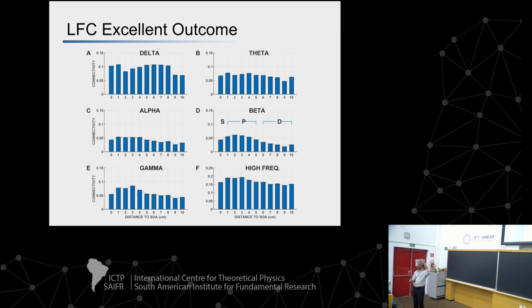If I look at all the different frequency bands that I mentioned earlier, I see that profile in beta, but I also see a hint of it in alpha, gamma, high frequency. All of these measures were made from 1 hour of awake, resting EEG. So the person's not really engaged in one task for 1 hour, so all language networks, motion, etc., are washed out. And we're hoping that what's remaining is an expression of the epilepsy. That's our thought. But we're seeing this profile repeated in the alpha through high frequency bands, but not really in the theta and delta bands.